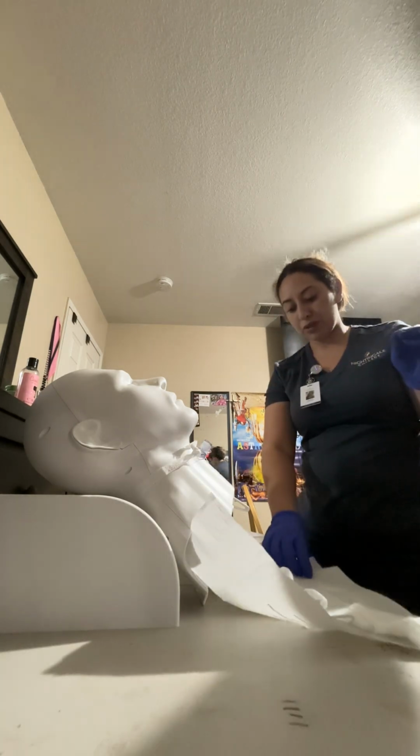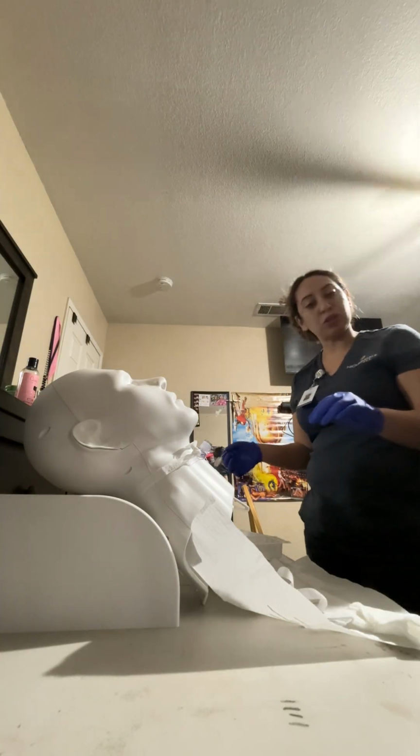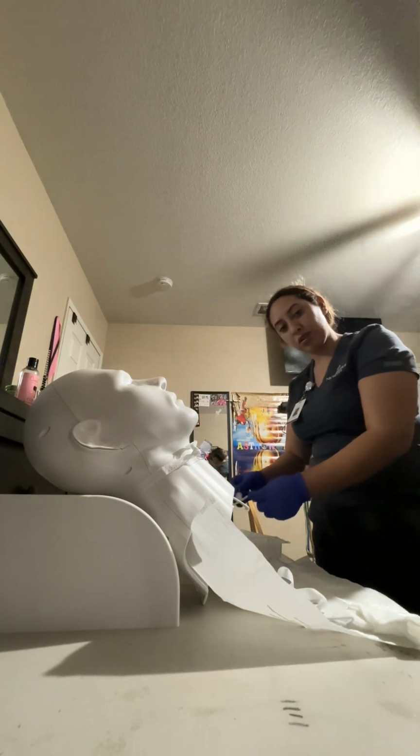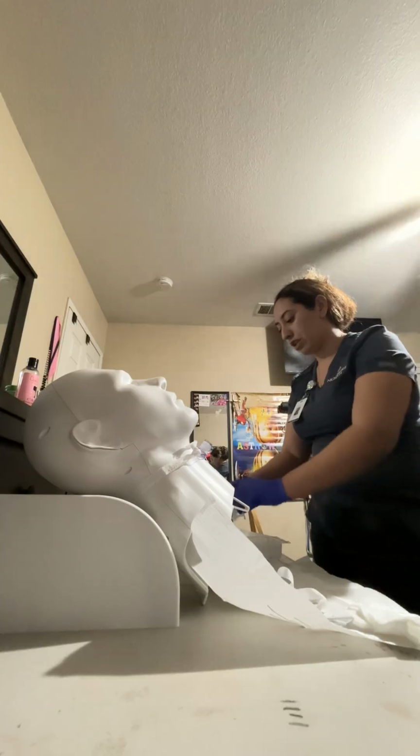I am then going to use my brush to scrub the inner cannula. So in the solution, I will scrub it. We'll clean it.